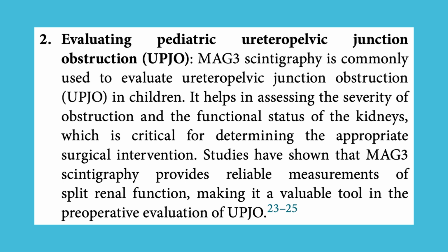2. Evaluating pediatric ureteropelvic junction obstruction, UPJO. MAG3 scintigraphy is commonly used to evaluate ureteropelvic junction obstruction, UPJO, in children. It helps in assessing the severity of obstruction and the functional status of the kidneys, which is critical for determining the appropriate surgical intervention. Studies have shown that MAG3 scintigraphy provides reliable measurements of split renal function, making it a valuable tool in the preoperative evaluation of UPJO.